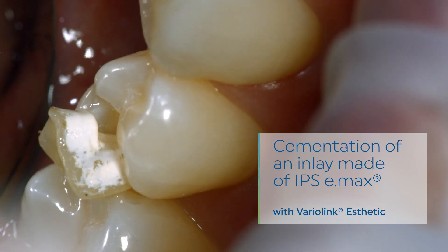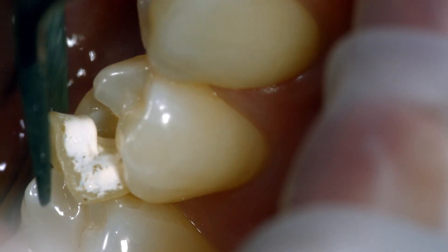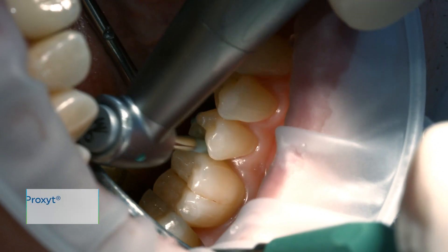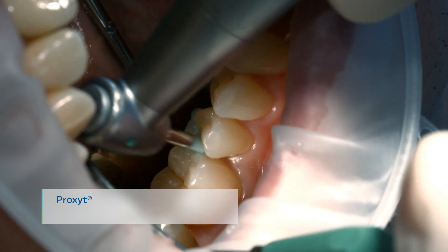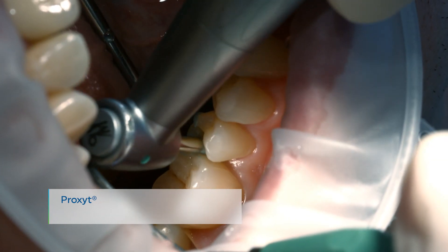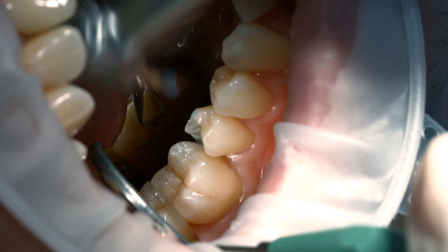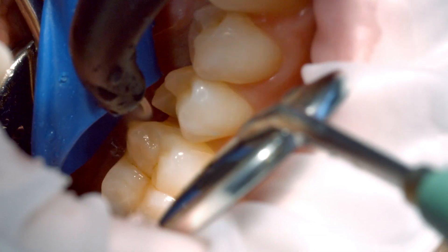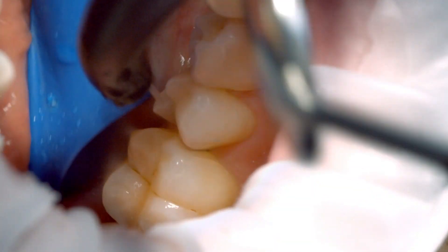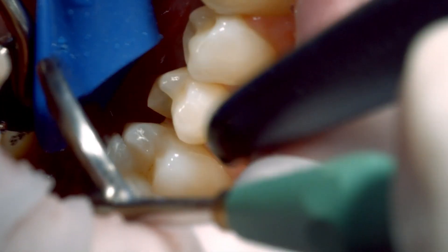Remove the temporary restoration. Clean the preparation with a polishing brush and fluoride-free cleaning paste, such as a fluoride-free Proxit. This ensures that all temporary cement residues are removed. Rinse the preparation with water spray and dry it with water and oil-free air.